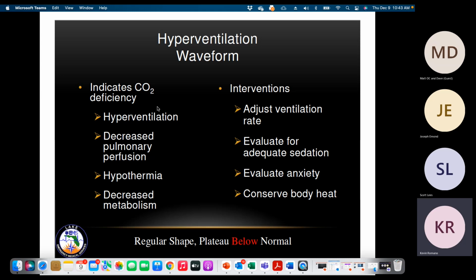The only problem with ours, Joe, is that the red bags that we have, they're all brand new. The problem with them is that the plug in the back of it is so easy to pull out. They're not hardwired in. So you've got to check those on your shift, because any bumps in the truck cause them to fall out. I'm tempted to put some tape around them and tape them in. You know, that'd kind of make that work.